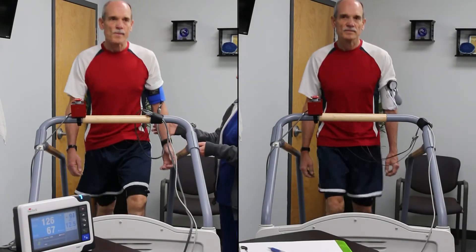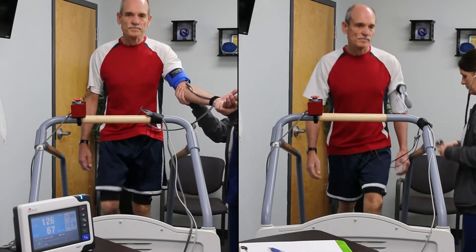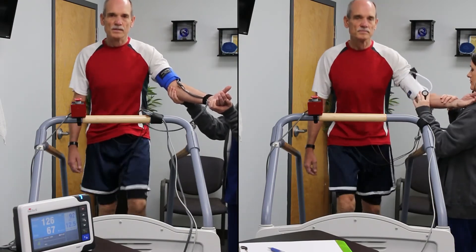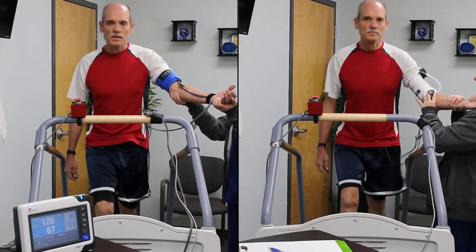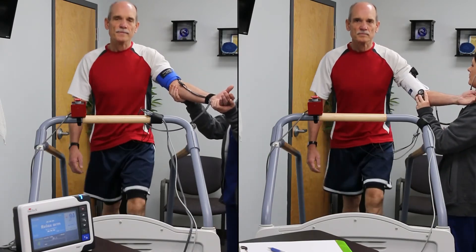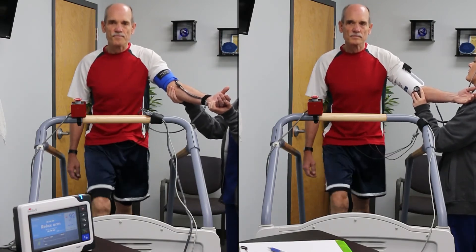Manual blood pressure becomes more difficult as the stress test continues. The Tango M2 continues to get an accurate measurement thanks to the finely tuned microphone in the patented Orbit K cuff. In the case of manual blood pressure, it can be difficult to hear the correct Korotkoff sounds over the noise of the foot strikes on the treadmill.